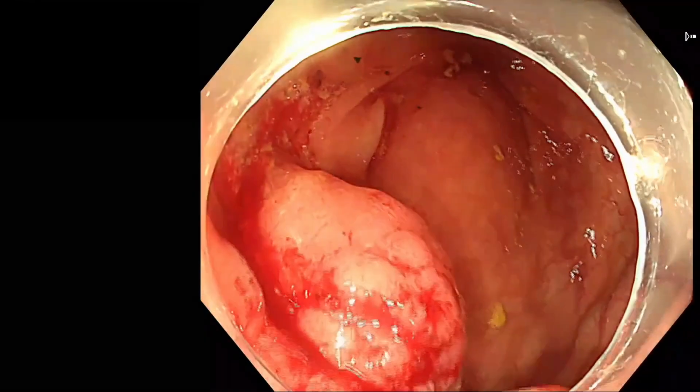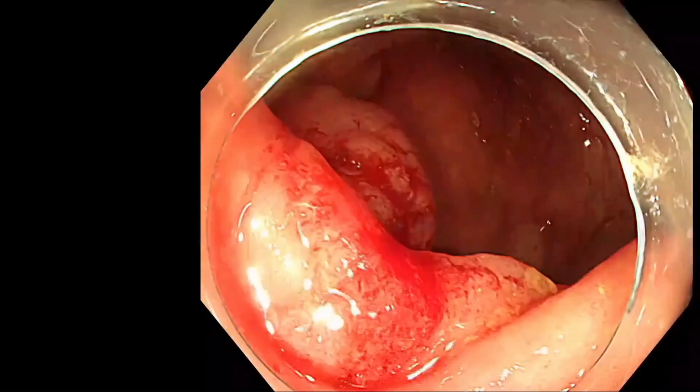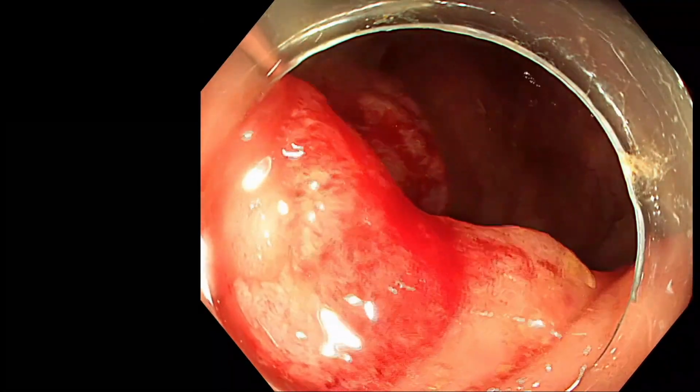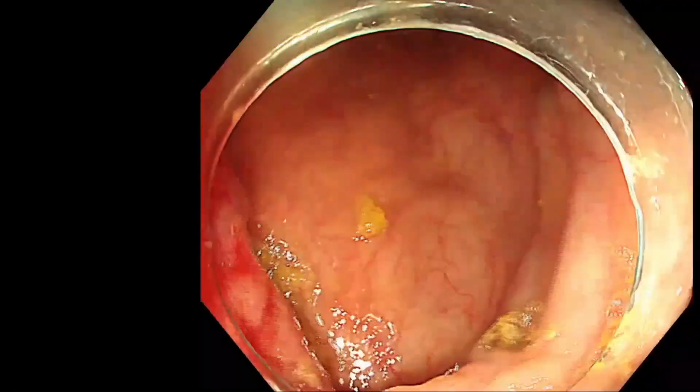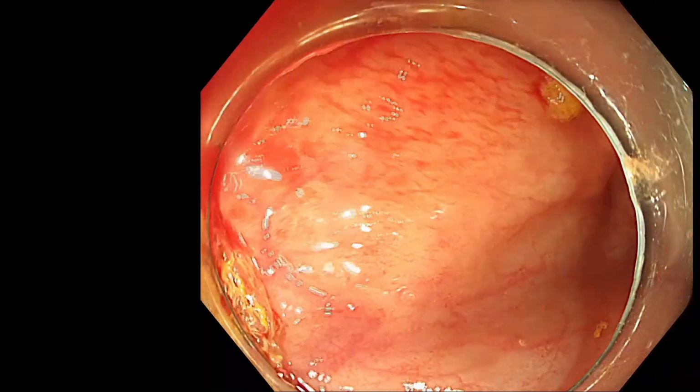And we're looking in the cecum here, just attached to one of the lips of the ileo-caecal valve is a polyp. But it's not just attached here, it's right around into the base of the cecum. And the question is, whenever you see a polyp in the cecum, where's the appendiceal orifice, where's the ileal opening?